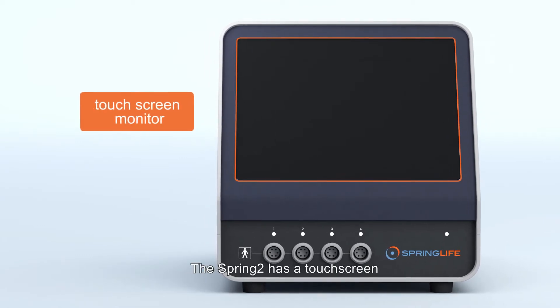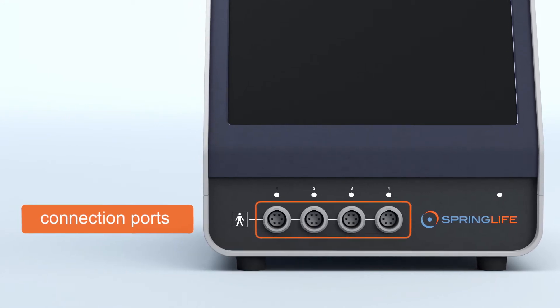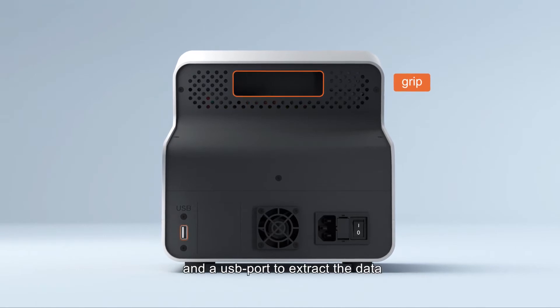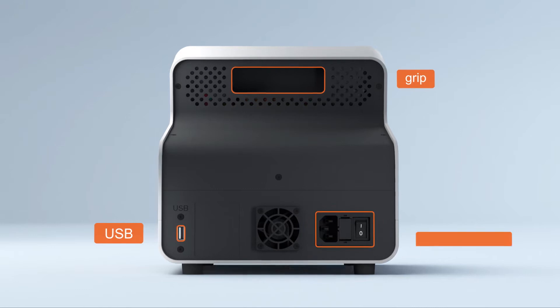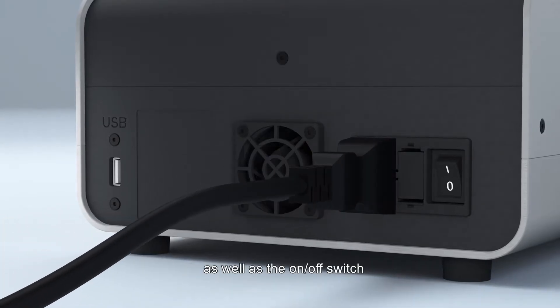The Spring 2 has a touchscreen and four connection ports with indicator lights on the front. On the back there is a grip for easy handling and a USB port to extract the data of last performed treatment. This is also where the power cable port is located as well as the on-off switch.